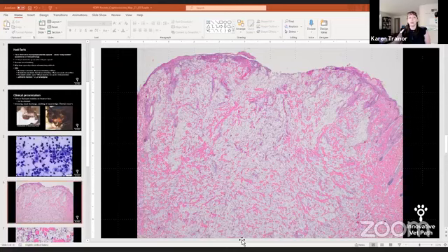So I think someone had mentioned when I posted a preview of this, it was sort of a party. I think that is spot on. Excellent description for this. So these guys do like to party, and they usually show up in pretty large numbers. But even on the H&E without special stains, you can get a sense that there's some sort of a capsule around this organism, and something that's creating that space within the tissue.